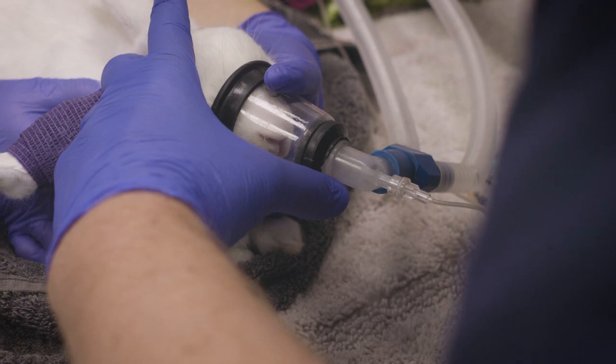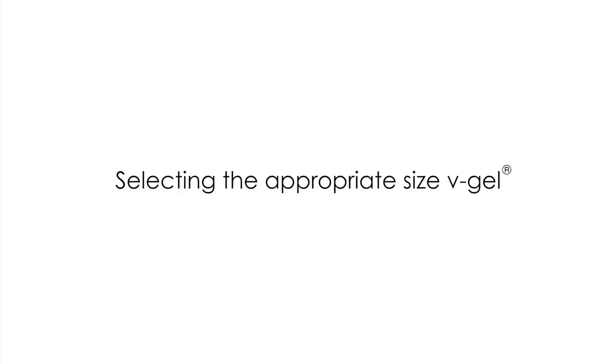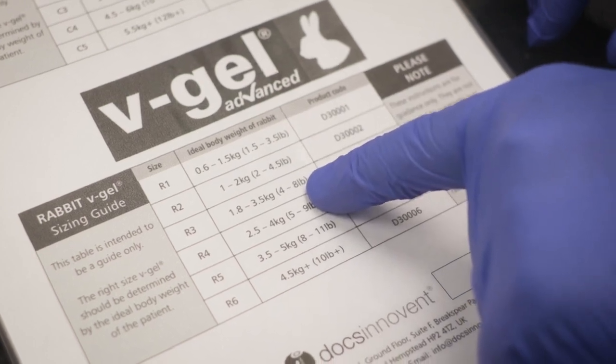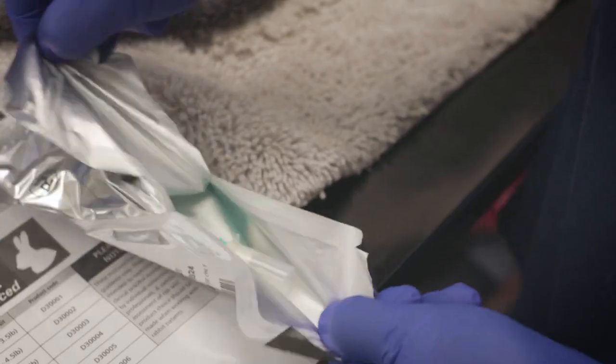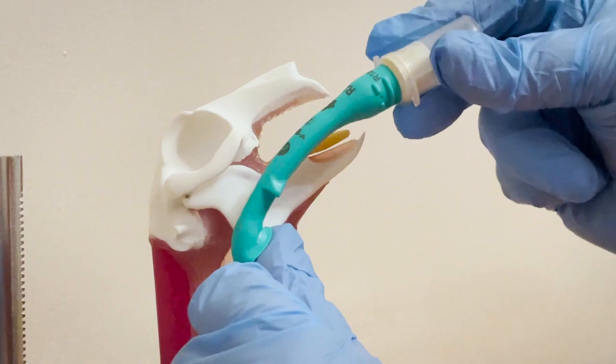Oxygenate the patient whilst you select the appropriate V-Gel. Using the size chart in the pack, select the correct size V-Gel according to the rabbit's ideal body weight. Confirm that the correct size has been chosen by measuring against the patient.